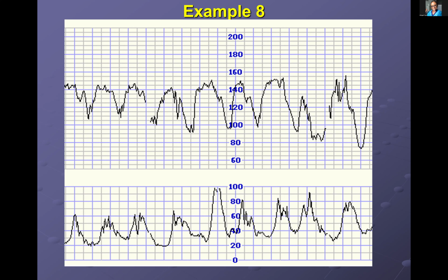Yes, on the latter part there are. Is that a late deceleration? Yes, they are. I think actually they're all late, because if you look at the contractions and you follow the lineup, this is late as well, and this one here is very late because the contraction is over here. The peak is here, and it starts basically when the contraction stops. You've got the deceleration. This one as well is late. You get the contraction, and then after there's the deceleration. Same here. So they're all late.